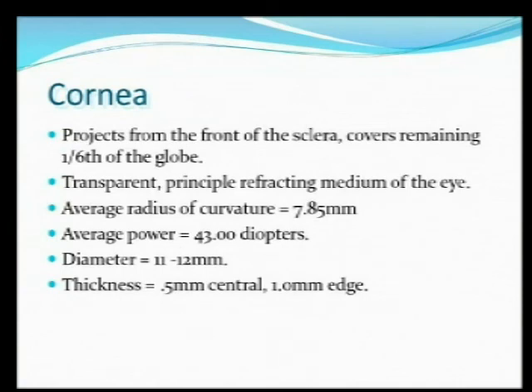One of the things we'll also measure in our pre-fit is the diameter of the cornea. The typical cornea is about 11 to 12 millimeters in diameter. Because the cornea is clear and it's hard to tell precisely where it starts and stops, we typically take a horizontal visible iris diameter measurement instead of an actual corneal measurement.